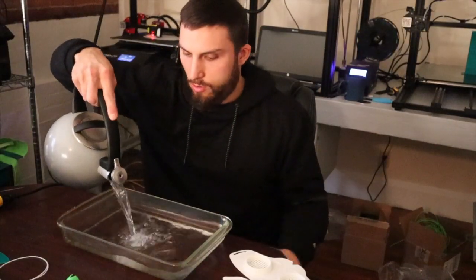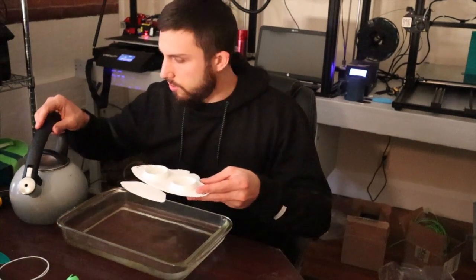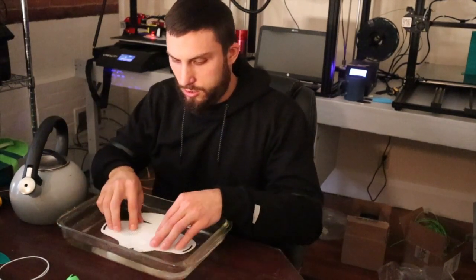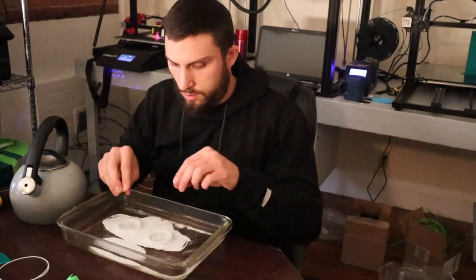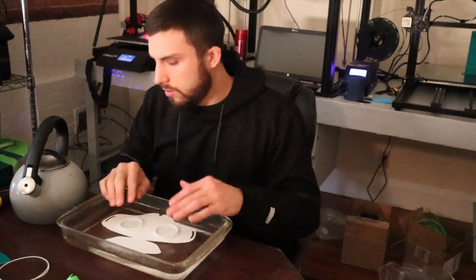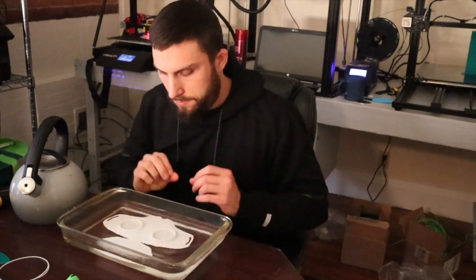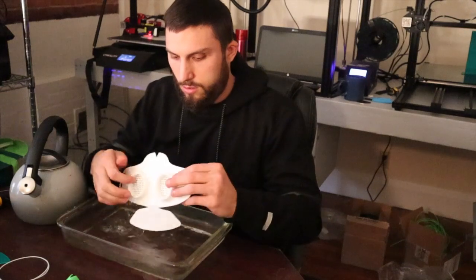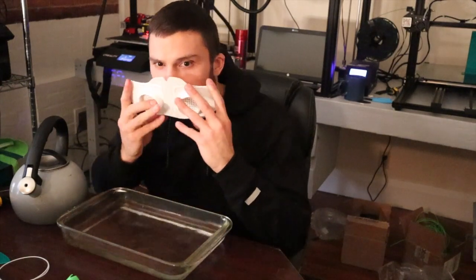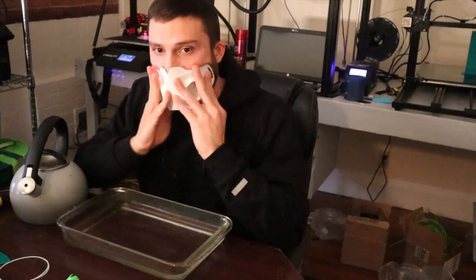Heat water up to about 160 degrees Fahrenheit, pour it into a dish, and submerge the mask. Flip it over and let it sit there for a minute to get warm. When you pull it out, it might seem really hot but it really doesn't hurt your face. Just get right into it while it's moldable — push the bottom flaps up and in, push the nose flaps down, and contour to your cheek.